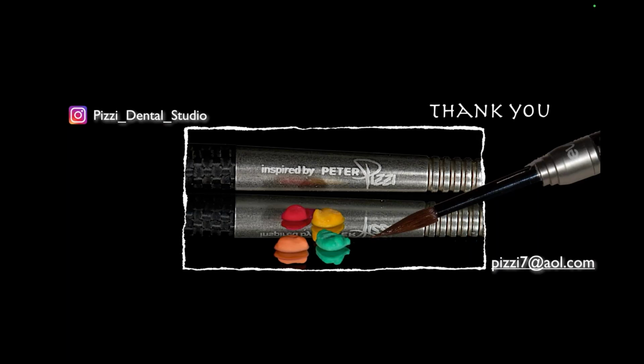As far as questions go, one of the questions was, Peter, the young lady with the window veneers, the two sets, how thin did you go on those? They were about 0.2 of a millimeter, if that. So very, very thin. And you did those by, they were done with refractory.